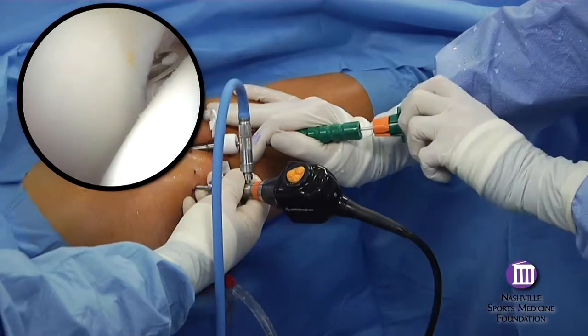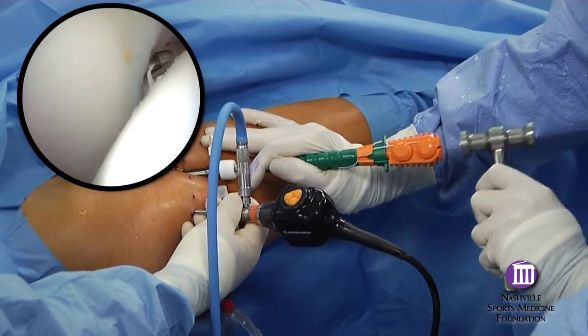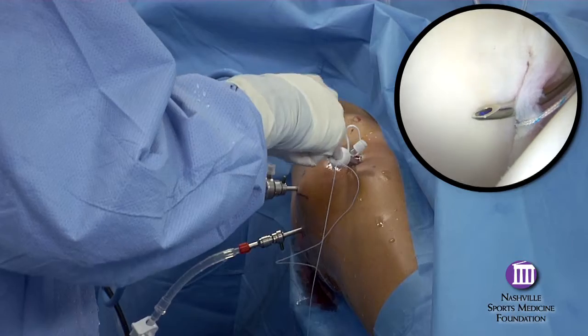For most anchor placements, this is the advantage of the more distally based modified anterior portal. Regardless of how the anchors are placed, the anterior portal usually provides the most versatility for managing the sutures.